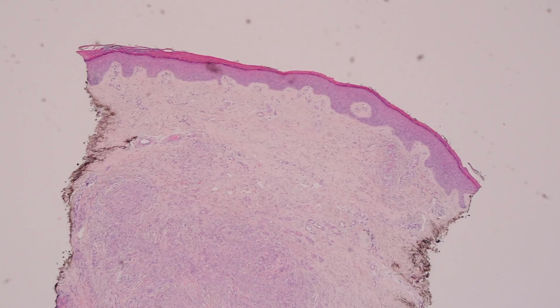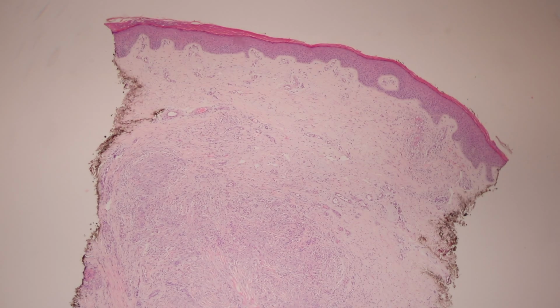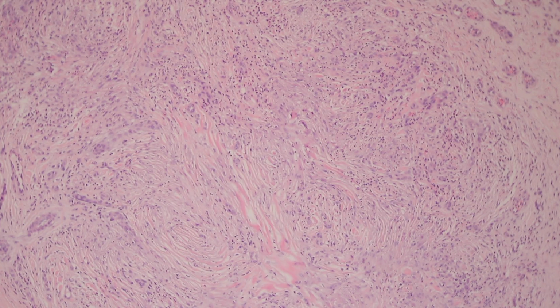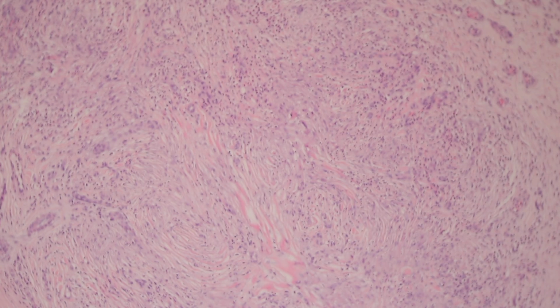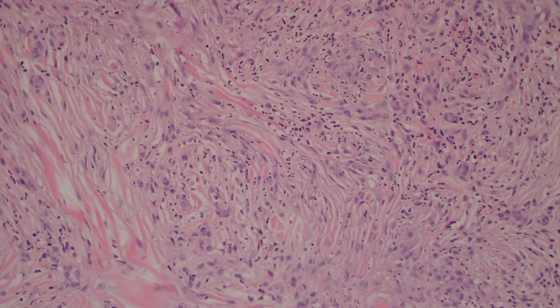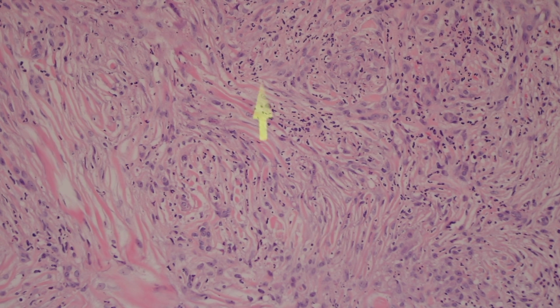This one is not quite so extensive and dramatic. Let me turn it around so it's the right side up. Not quite as extensive as the last case, but you can see there's a nodule down here. This slide is a little faded, but it's a really good example of that kind of onion skin fibrosis that you can see. Lots of small vessels trapped in here. These little plump cells are actually endothelial cells. So these are tiny little vessels that are so compressed that you can't even see the lumens anymore.